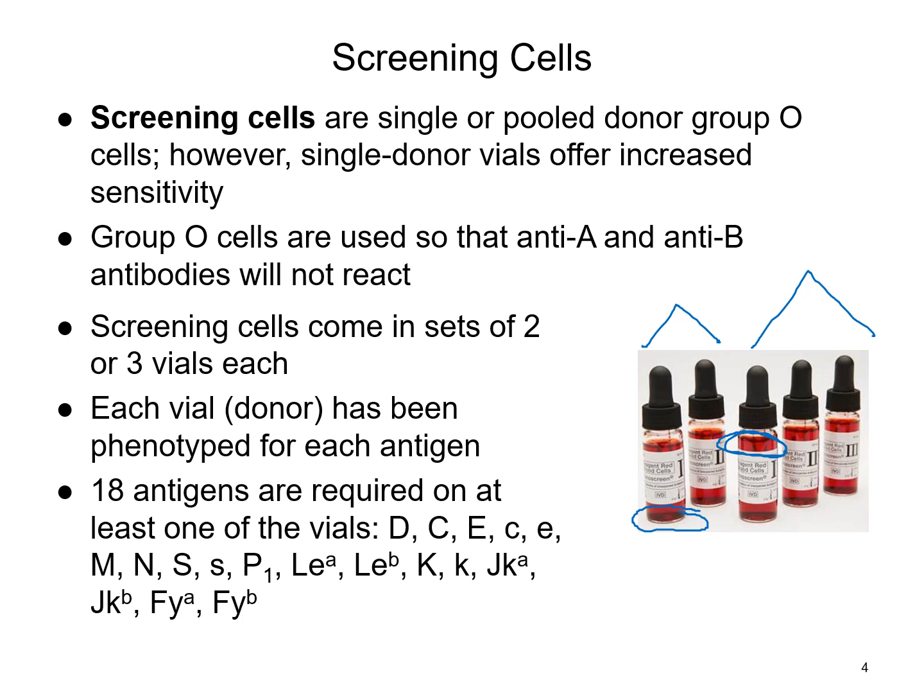The supernate for these reagents is hemolyzed. If I were to receive this in my lab from a new shipment, I would reject it because it does not pass visual inspection. There is some lysis of those cells going on, which means hemoglobin is leaching out into the supernate, causing that hemolyzed look.